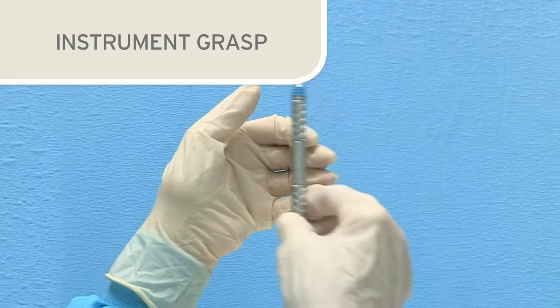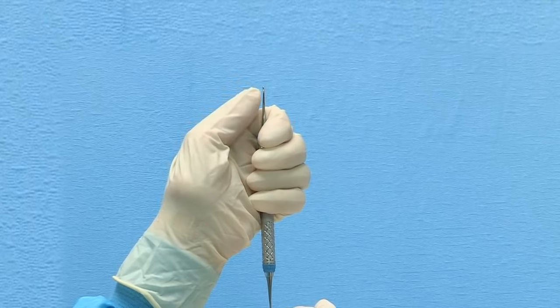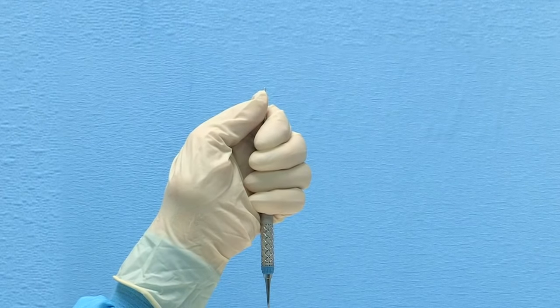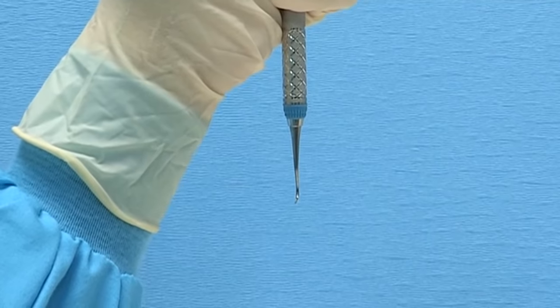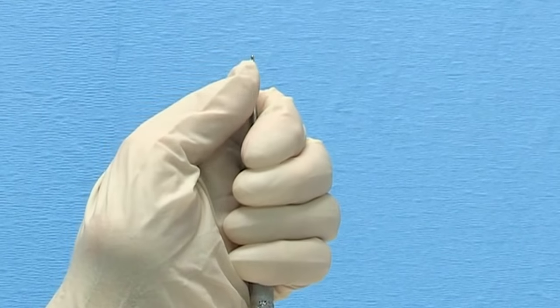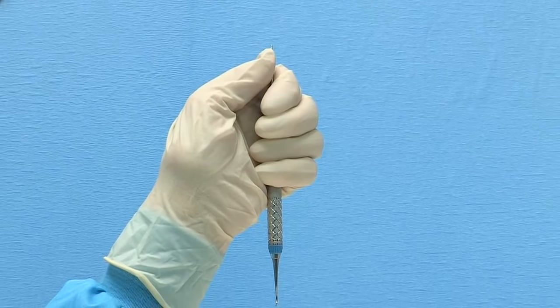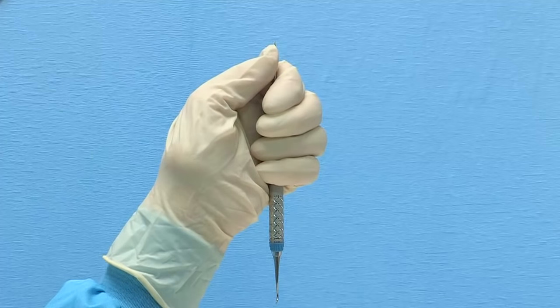Whether sharpening scalers or curettes, the instrument grasp will be identical. In your non-dominant hand, hold the instrument vertically with a secure palm grasp. The blade to be sharpened should be at the bottom with the toe pointed toward you. Rest your thumb on the upper shank — this is very important as it will help stabilize the instrument when pressure is applied on the blade during sharpening. Resting your elbow on the table will also aid in maintaining stability.